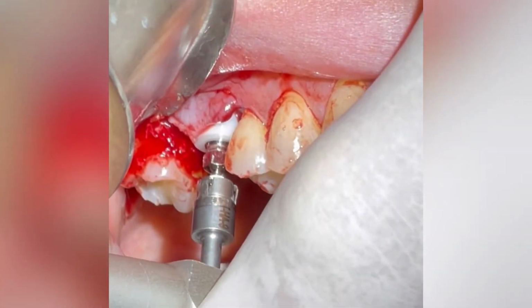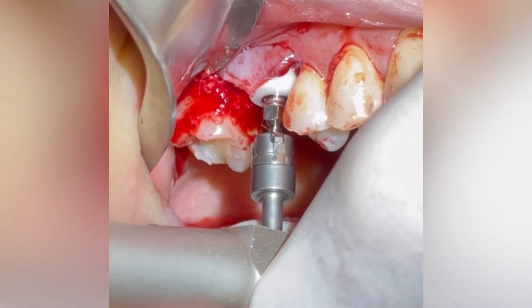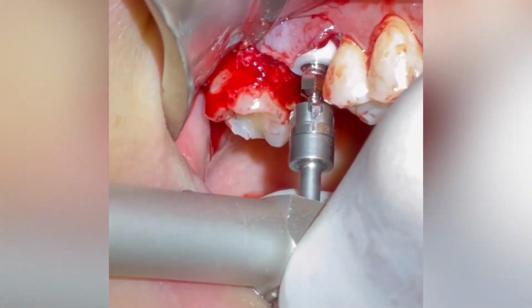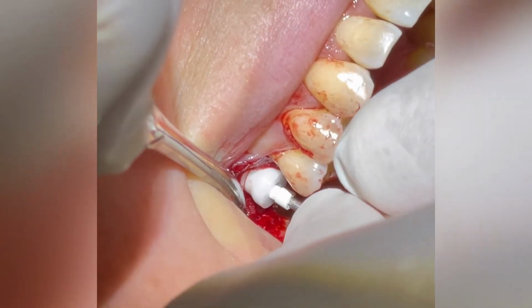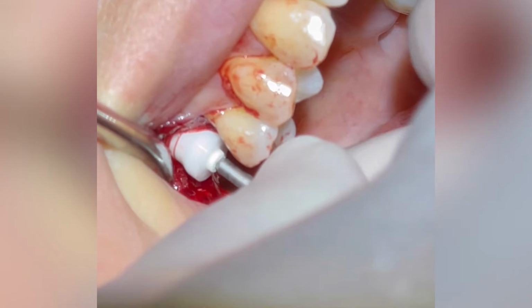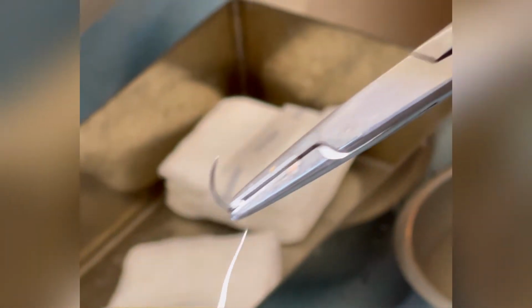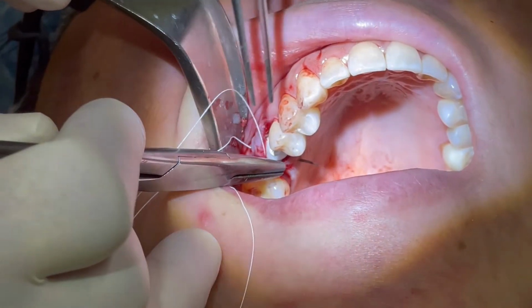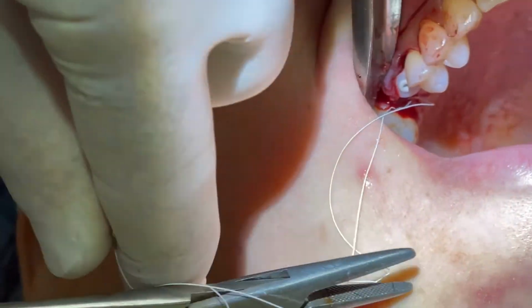The implant is torqued in at around 32 Newton centimeters. A PEEK screw is inserted to protect the implant. The conservative flap is sutured back, and the fact that this is a tissue level implant allows for the keratinized zone of the flap to rest on its buccal aspect.